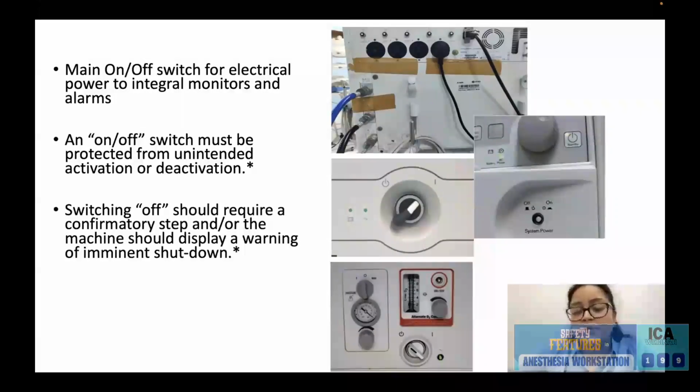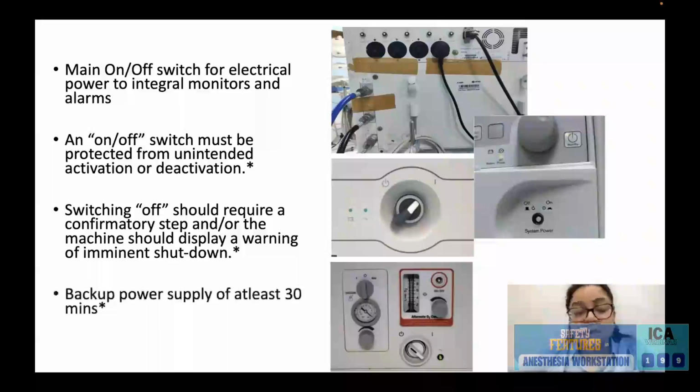Then switching off should also require a confirmatory step. That is, it should flash a shutdown message, or the machine should display a warning sign of the imminent shutdown. And in case of a shutdown, a battery backup of at least 30 minutes should be present.